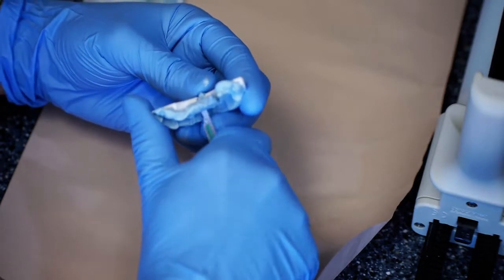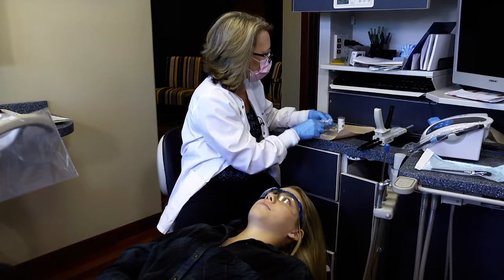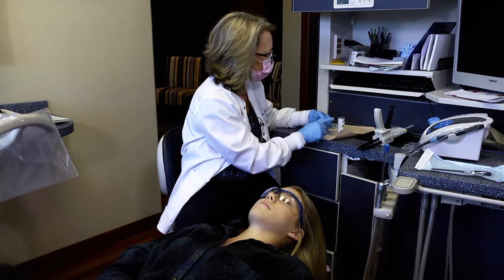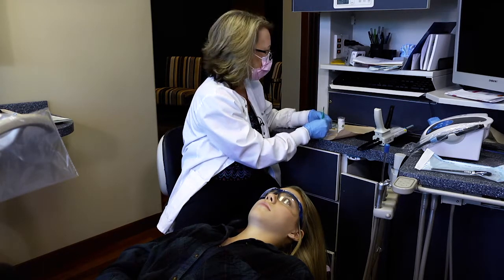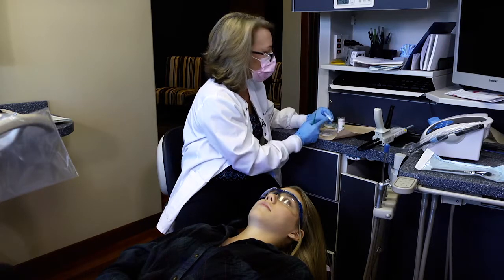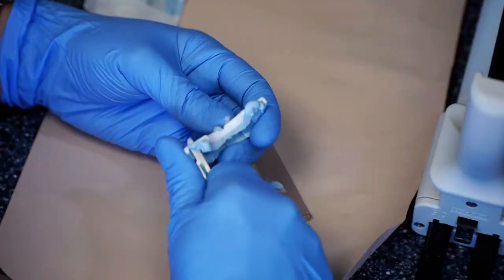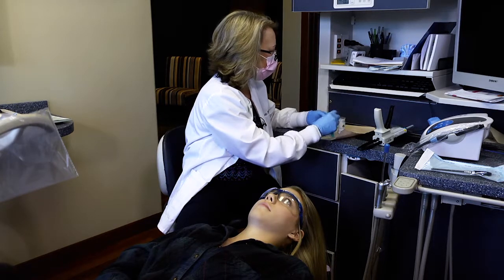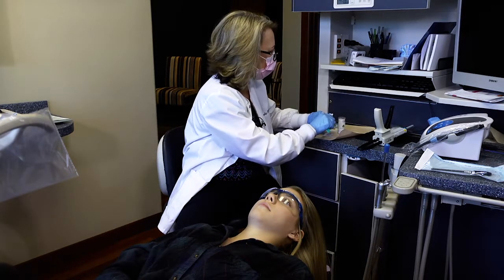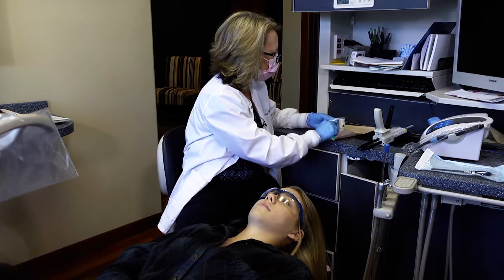So I'm just trimming off the excess that's on the lingual of the QuickSplint. I'm not shortening it, but I'm making sure that it's flush with the white plastic so that it's not an irritant to Jenna's tongue. Why am I not shortening it? Because it's going to actually help me with retention. I also then trim it flush on the distal, using the platform again as a guide, using the QuickSplint as the guide for where I want to trim my bite registration.